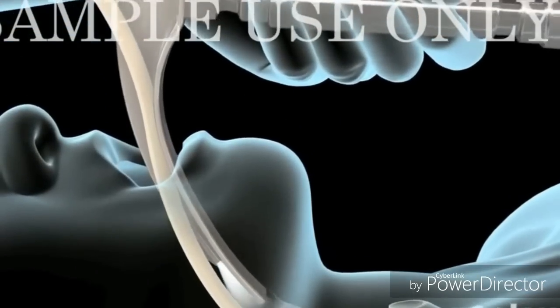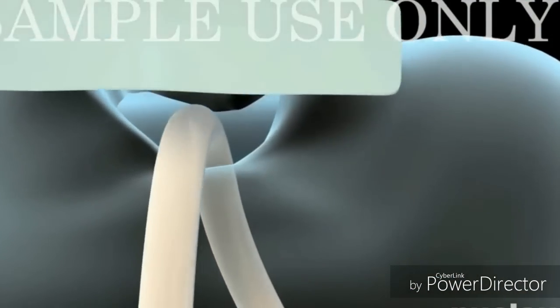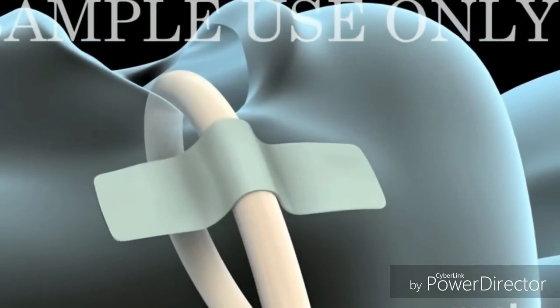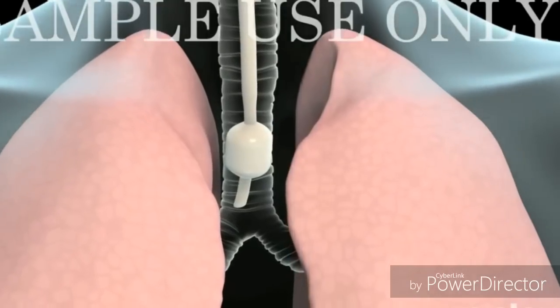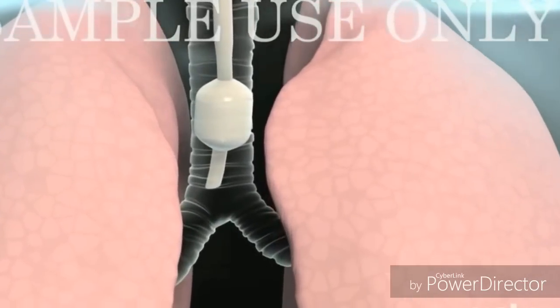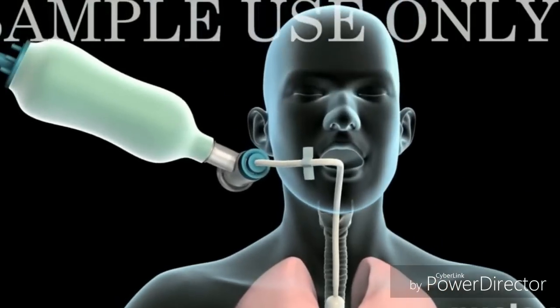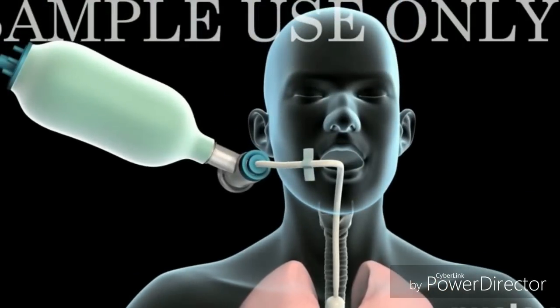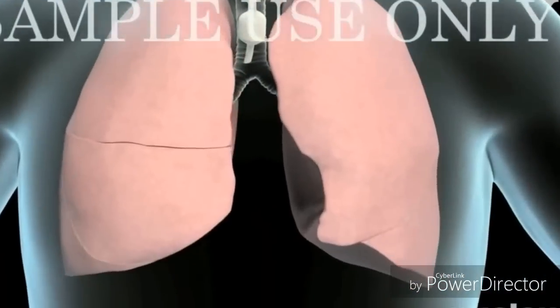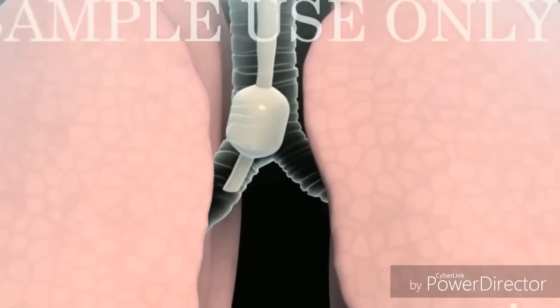Now gradually remove the laryngoscope. After removal, the endotracheal tube is fixed at the corner of the mouth. The air entry in both lungs is then checked with the help of the Ambu bag, and the expansion of the lung on both sides is observed.